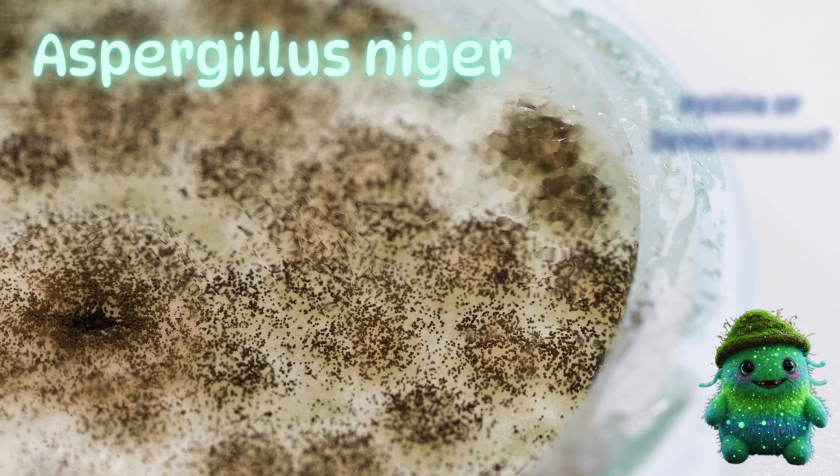Is it hyaline or dematiaceous? It has a black peppered surface due to dark conidia, but because it has hyaline hyphae, it falls under the hyaline umbrella. Once mature, it becomes a conidia factory producing what seems like quintillions and sextillions of dark round conidia. If these conidia escape the culture, they can lead to horrible problems with cross-contamination of other cultures.